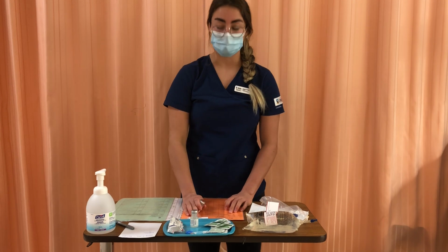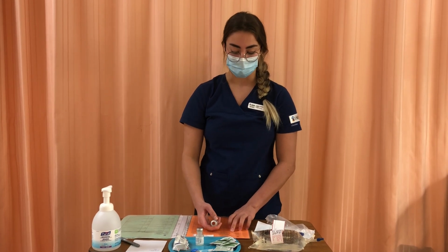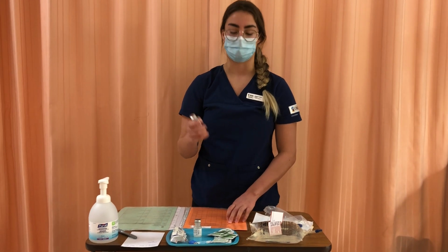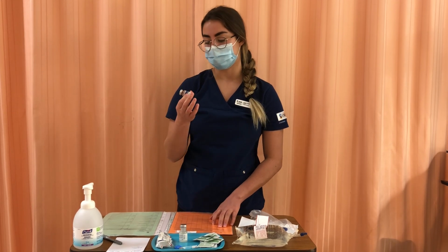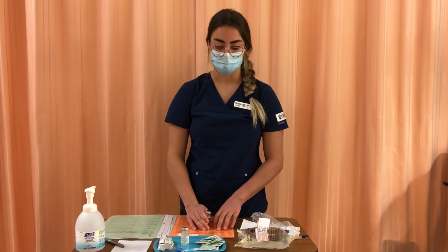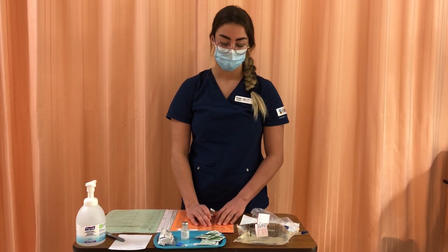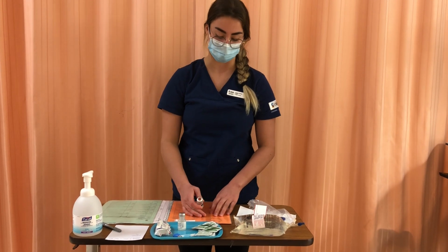So we have right patient, Benicio Vines, right medication, Azithromycin, right dose. This is 400 milligrams. This is a 500 milligram vial, so I have sufficient amount to pull. Right route, IV, this is an IV medication. Right time and frequency, it's scheduled for September 15th, 2020 at 0600. No one's given this medication yet, there's no one signed for it, so I'm okay to give this medication.